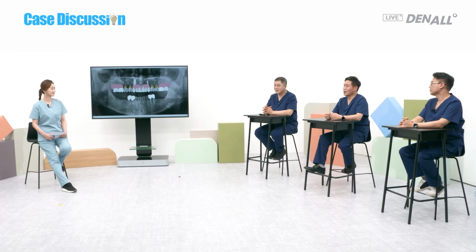Yes, it is. Let me ask a question. I use the locator in my case. I do the surgery and the prosthesis is done by a private practitioner. As you said, 2 locators can be done on the mandible, and on the maxilla, bar attachment is used. When I discuss this with many doctors, the lab process of bar attachment sounds very challenging, so they tend to use locators on the maxilla. Do I need to tell the prosthodontists to use bar attachment on the maxilla?